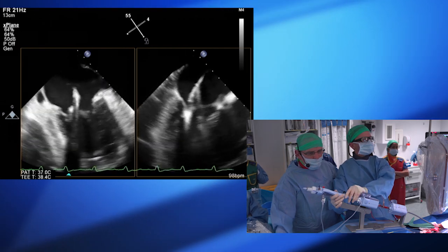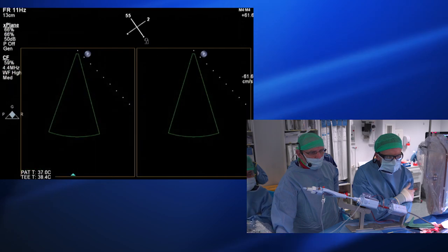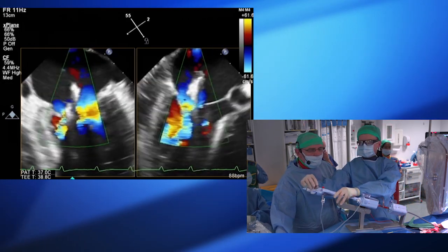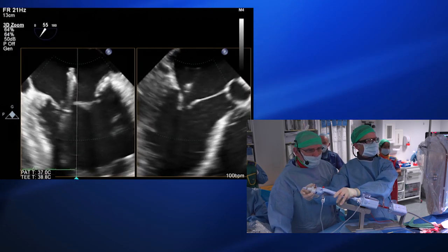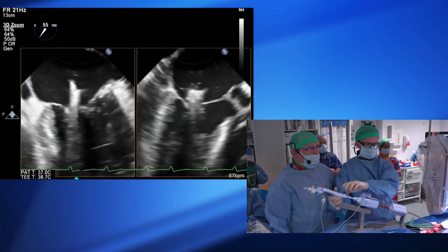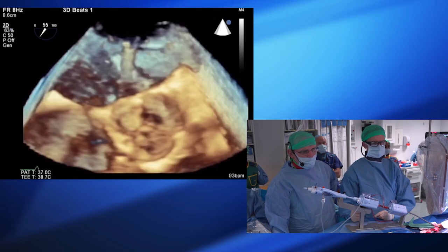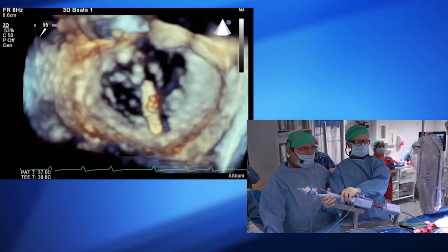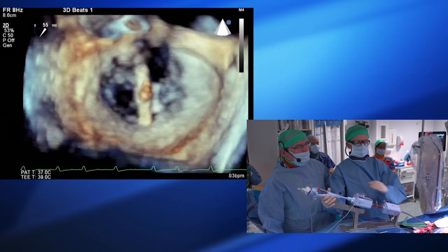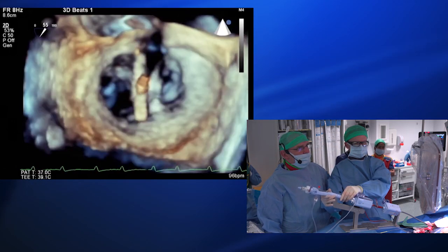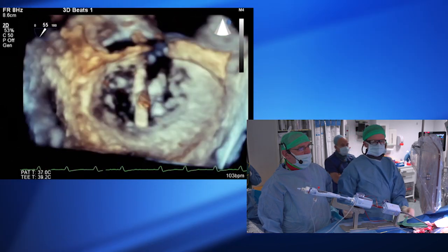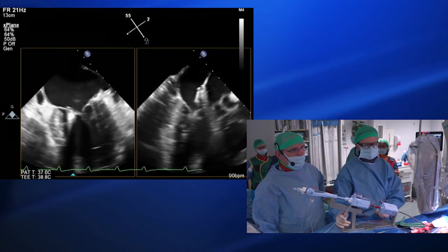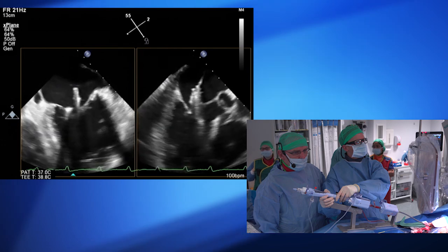I'm just going to position over the valve. With colour, that's kind of where we were talking about — just to the right of the medial jet. Let's orient the clip. When there's already a clip in there, you have to close the clip across the valve so you don't interact with the XTR with the longer clip arms. 3D on-fast please. Over the valve on fluoroscopy I can see I'm not interacting with the other clip — I'm just going to clock. We want to be 12 and 6-ish. That's sort of 12 and 6, pretty much parallel with the other clip, which is a nice position. On fluoro it looks like we're quite far away, but on TOE it looks like we're quite close, so I think that's fine.